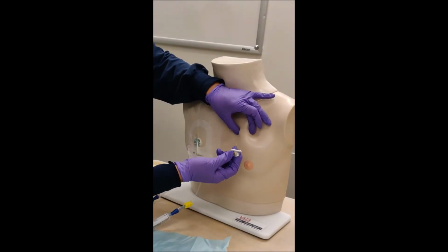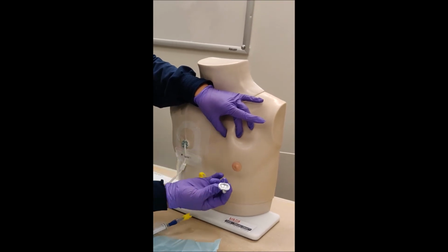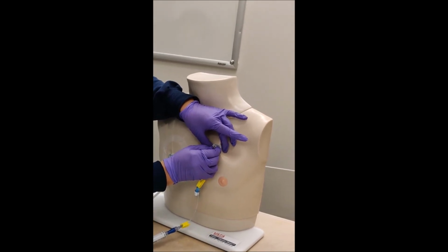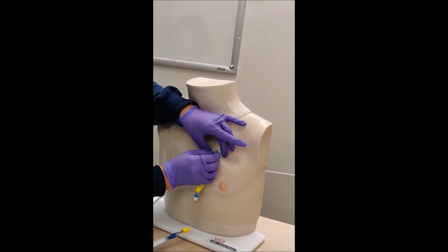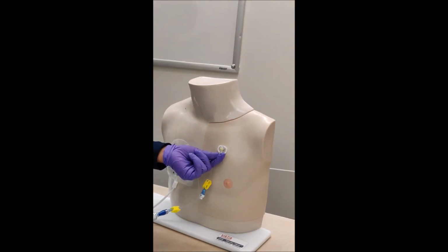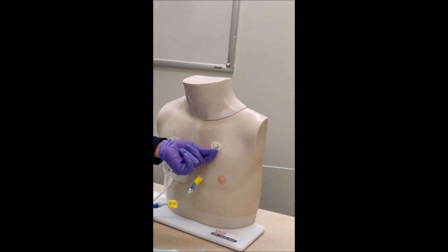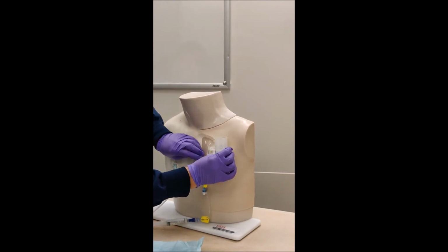Now once we're ready, and we're holding it right in the middle, now we're going to just sort of rest my finger on the chest here, and then I'm going to go in a 90-degree angle, and I'm going to go right straight, and then I'm going to go once I find resistance. That's usually the end part of the port. Once you've done that, I'm going to flush it, and then I'm going to pull back, and then I'm going to be able to see blood. Once I see blood, that means that I'm in. So once you apply we'll just put the dressing, change over.